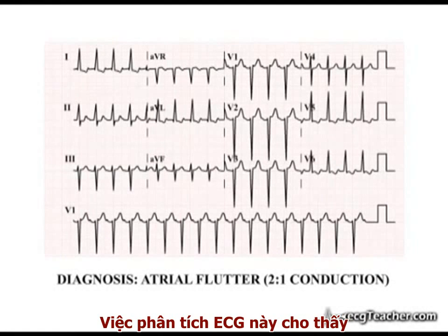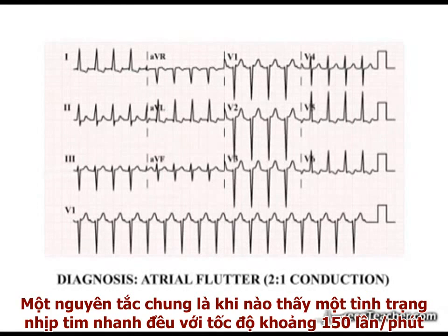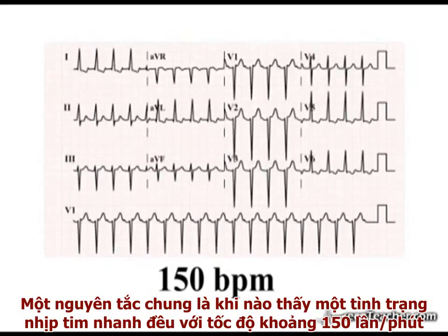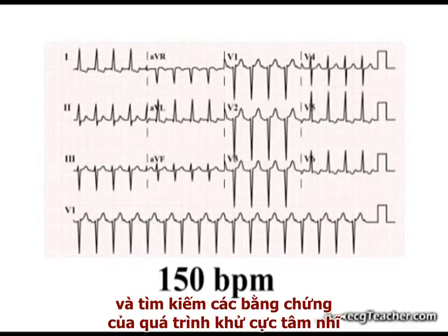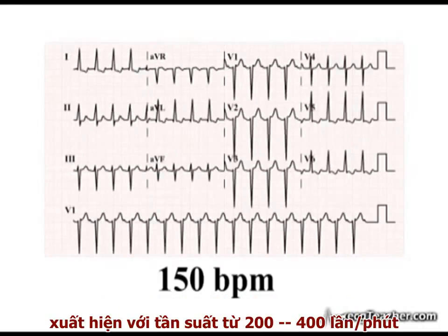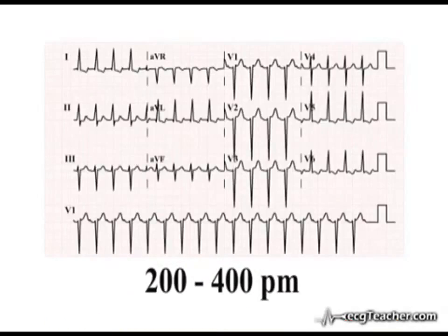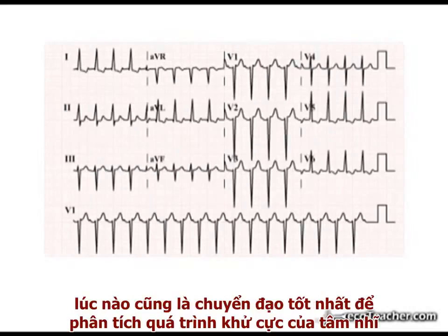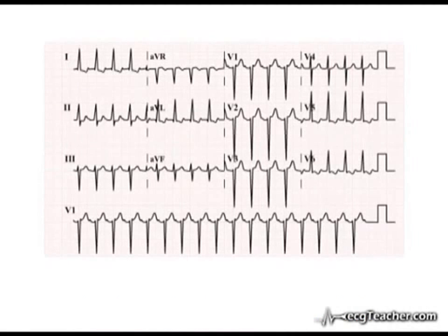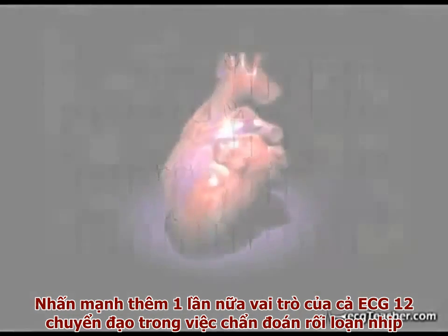Analysis of this ECG shows how easily one can miss this diagnosis. As a general principle, when faced with a regular tachycardia demonstrating a rate of or close to 150 beats per minute, always examine the ECG closely for flutter waves — any evidence of atrial depolarization occurring at a rate in the region of 200 to 400 times per minute. This ECG also emphasizes the fact that lead 2 is not always the best place to analyze atrial depolarization, highlighting again the value of a full 12-lead ECG in the diagnosis of arrhythmias.